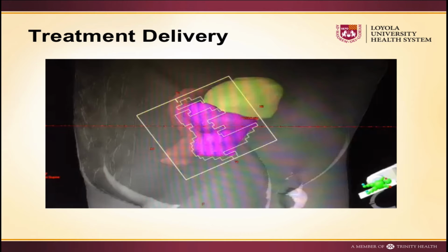In our clinic, we're waiting for a new system to come through, where we'll be able to place the fiducials, and there's a device in the treatment machine in the room that can detect where those fiducials are. So if the patient passes gas and it's outside of our tolerance, then the treatment is stopped and the patient is realigned.